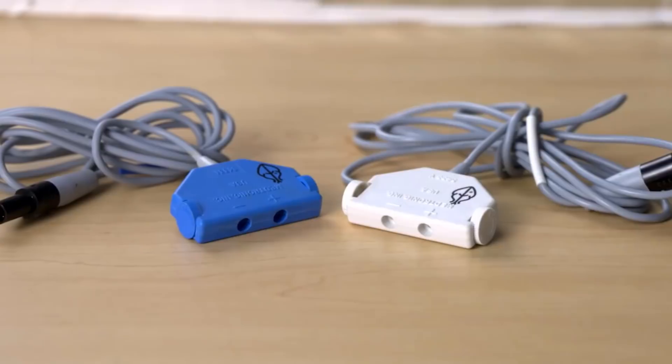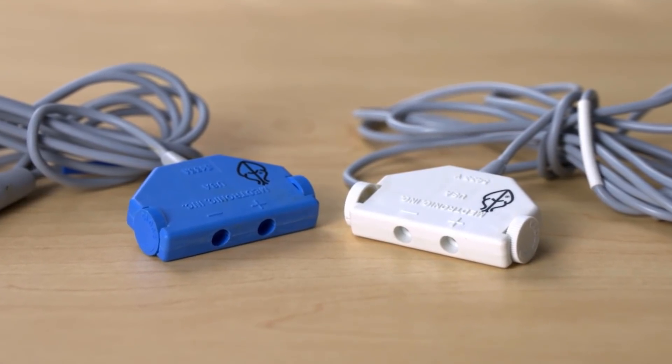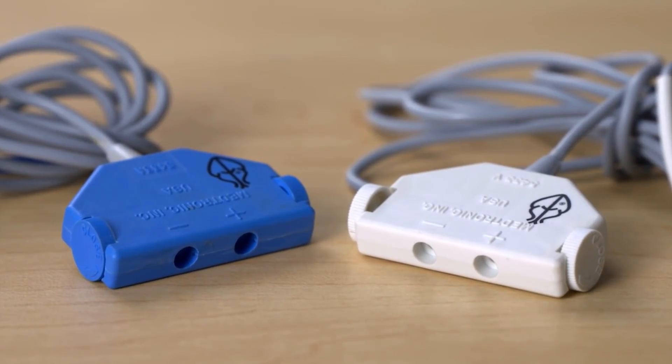So the same cable functionality, just color-coded for the heart chambers. Now take a look at the end of this cable. It looks like they will accept a lead directly if it has exposed pins. Correct. And can you see the marks on each one? There is a positive and a negative port.